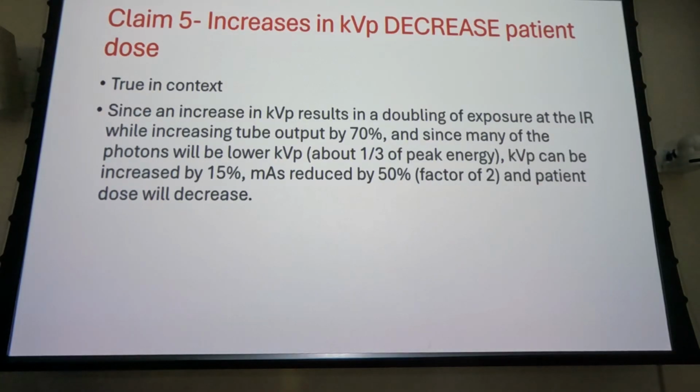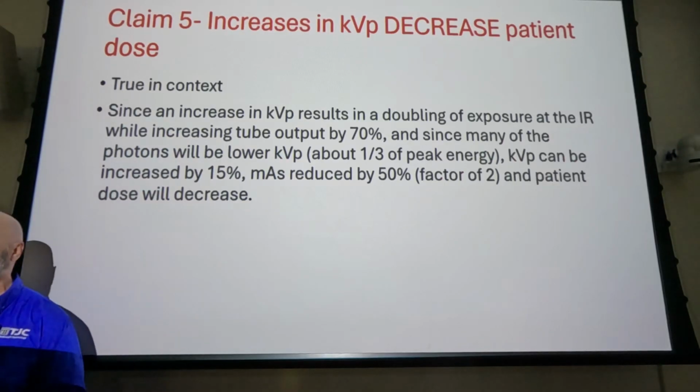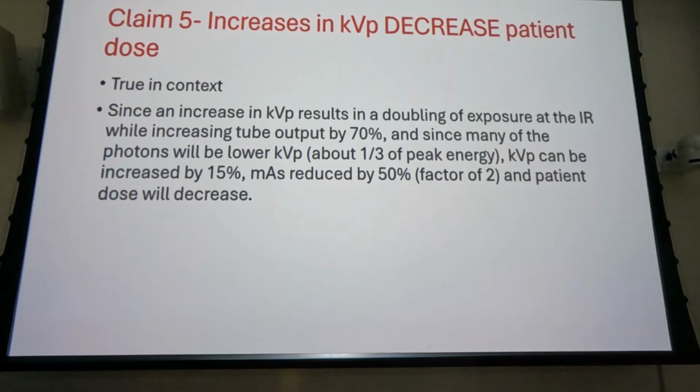So what's half of that? 3.5, right? 3.5 plus 7 gives you 15%. So that puts you at 77.5 kVp. Are you ever going to be able to get to 77.5 kVp? Do you think that half kVp means anything in the world? No, it does not. So 77, 78, either one, your image is going to be identical.